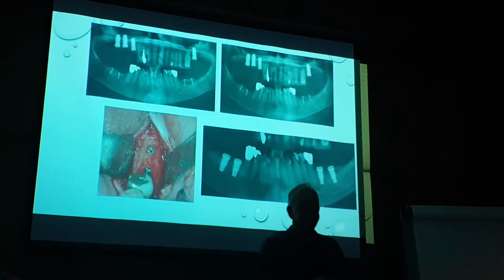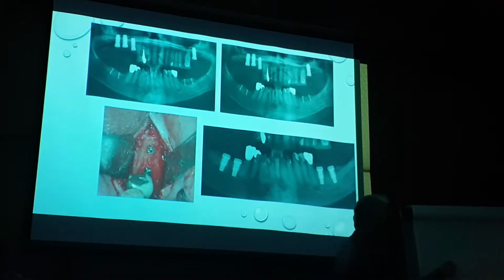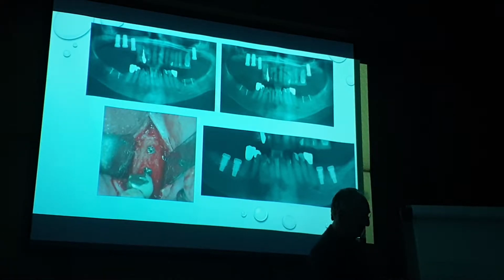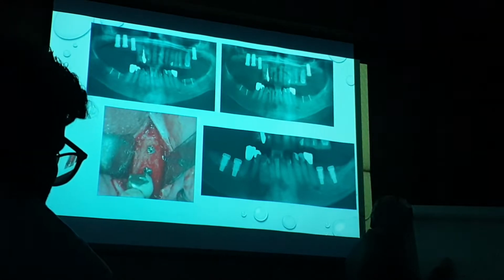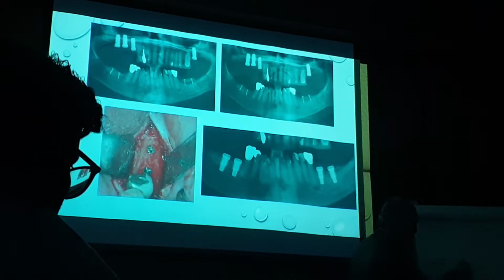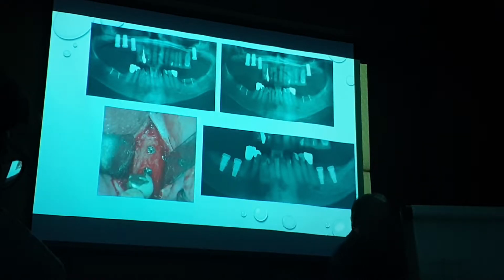Here's your first defect. If you were to try to do a KHOURY bone plate in this case, which would look like this, you have to put 2 bone screws in. The bone screw would have to then look like this. You know how difficult it is keeping that bone plate in that position when you screw these things in? It's almost impossible.